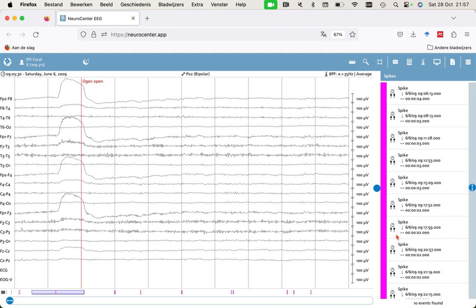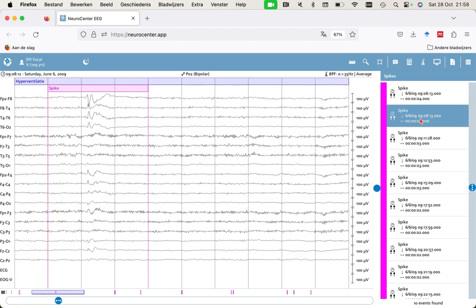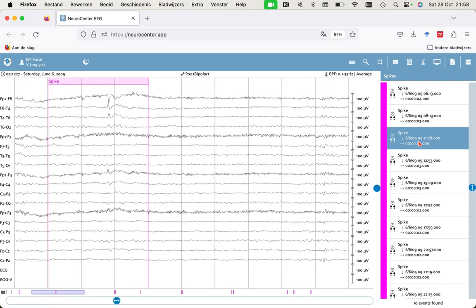We can see that there are 10 events found, and we can easily click them to see what it's found. We see a very nice example of a focal epileptiform discharge of the frontotemporal right lobe. And another example and another example.